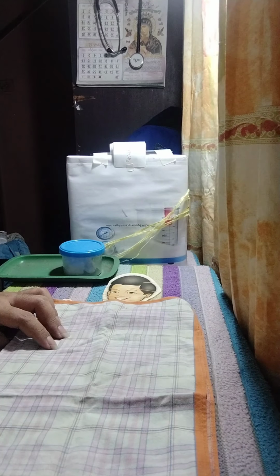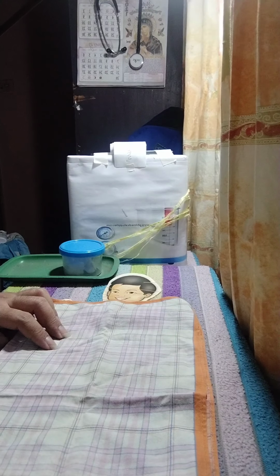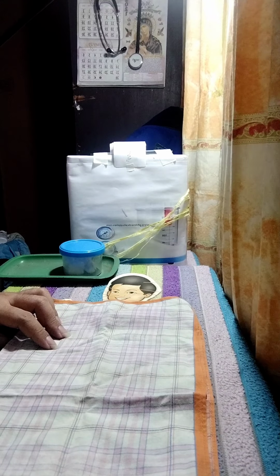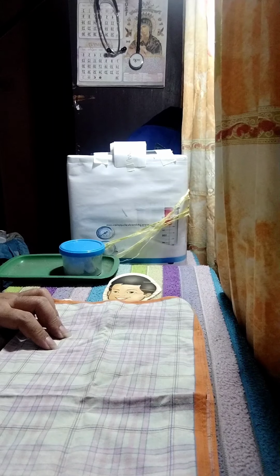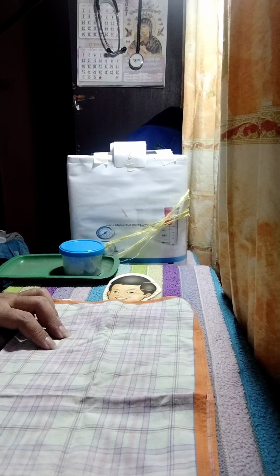Next, select the flat, fleshy areas on which to place the electrodes. Avoid muscular and bony areas. If the patient has an amputated limb, choose a site on the stump. Third, if an area is excessively hairy, clip the hair and do not shave it. Clean the excessive oil and other substances from the skin with soap and water and dry it completely.